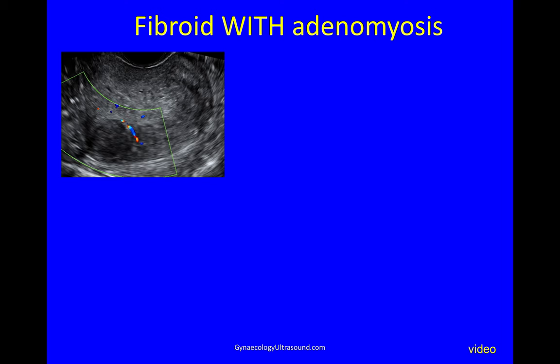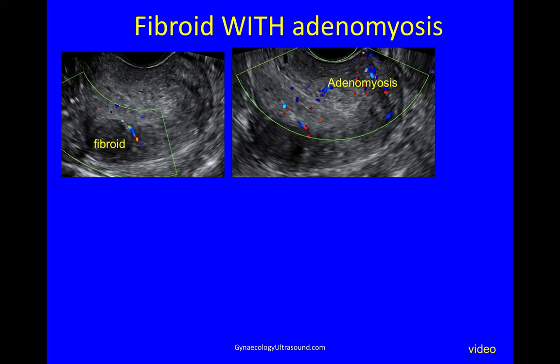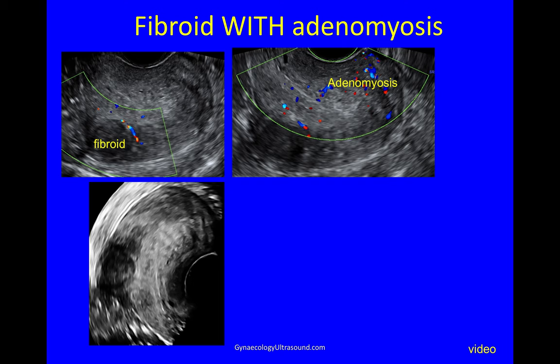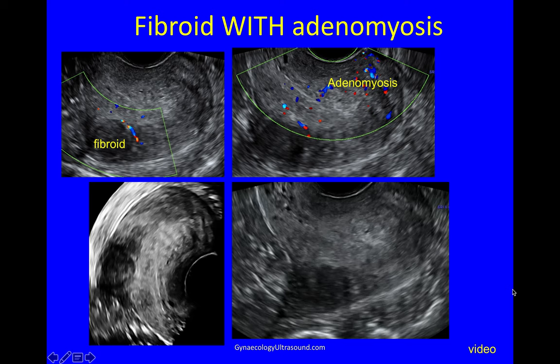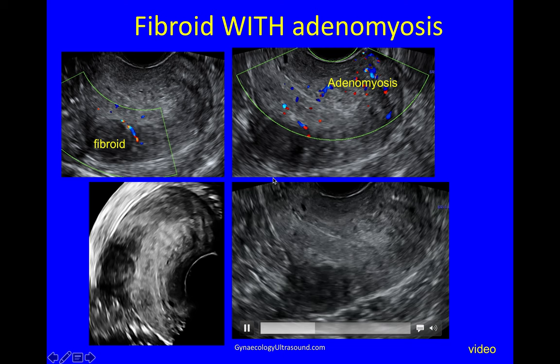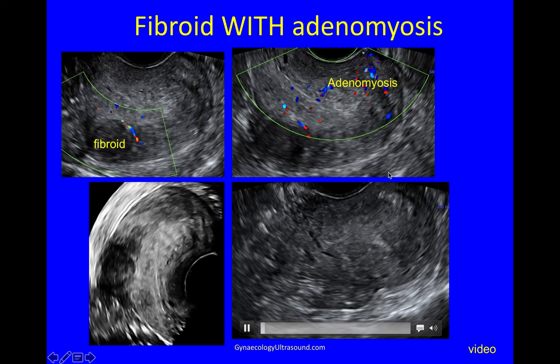Fibroids and adenomyosis can coexist. In this case with a retroverted uterus you can see a fibroid with circumferential colour Doppler flow alongside adenomyosis where the vessels traverse the lesion. On 3D the fibroid is almost subserosal, and you can see the adenomyosis with little myometrial cysts. In the video you can see the endometrial cavity very clearly but the endomyometrial junction is very indistinct, and there is a mass in the posterior wall with myometrial cysts.